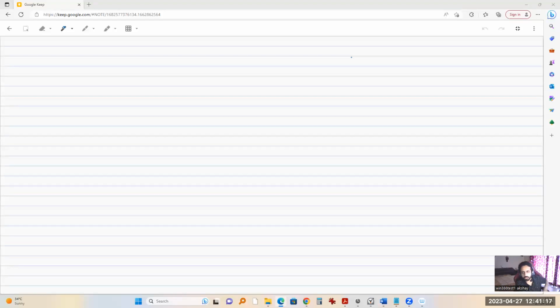Okay. Good morning, everyone. So today we'll be discussing one very interesting and very important topic in radiology. That is MSK radiology. Okay, we'll start off with some of the basic things about fracture. Then further on, we'll discuss each site-specific thing.